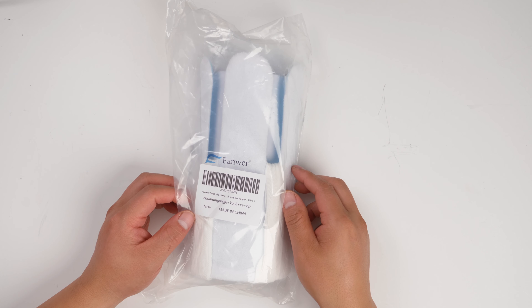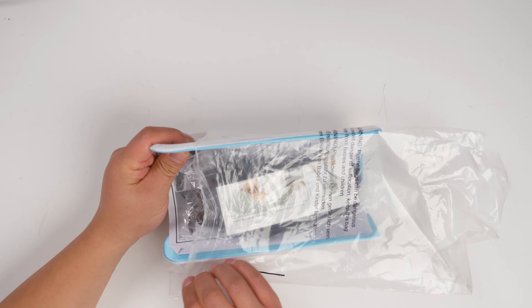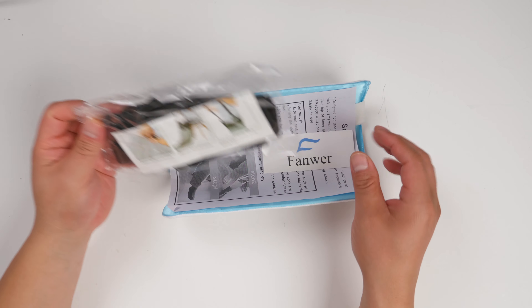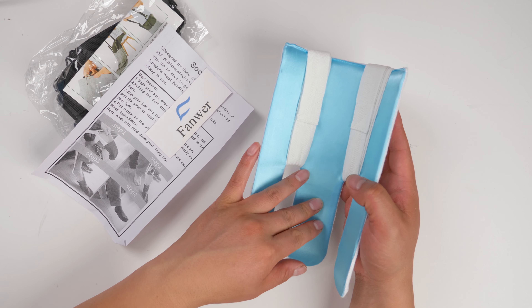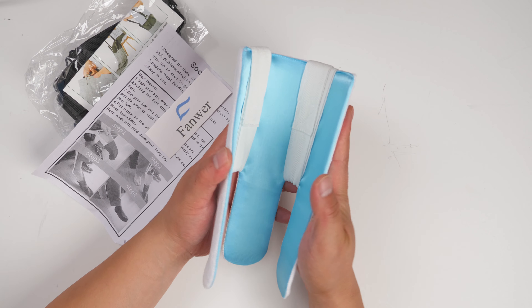This is the Fanware Sock 8 device. The inside is smooth, the outside is a little bit rough, and it's soft.